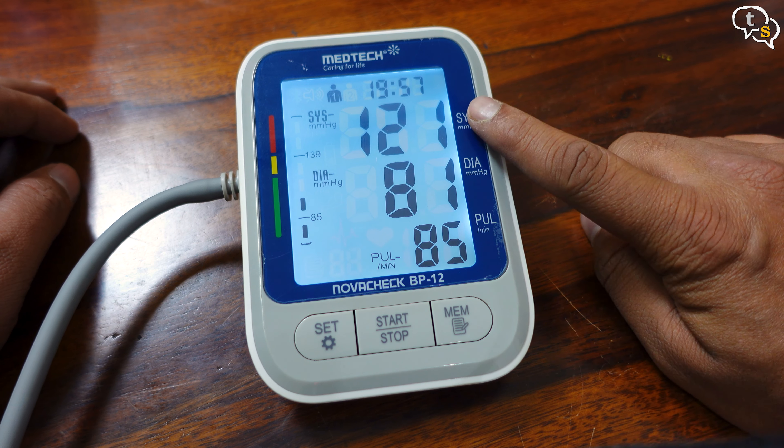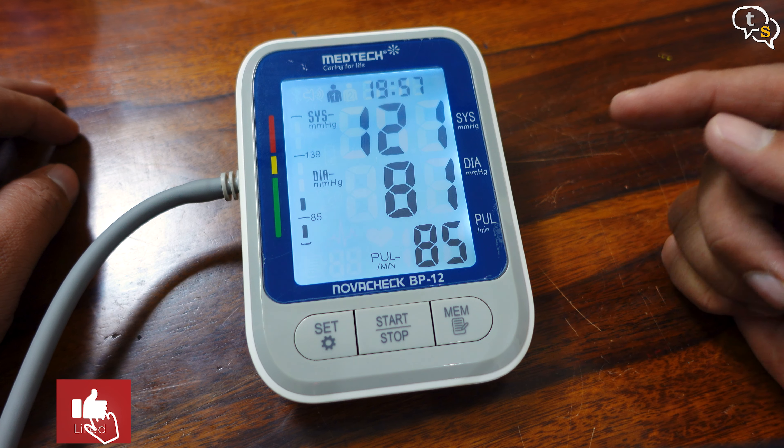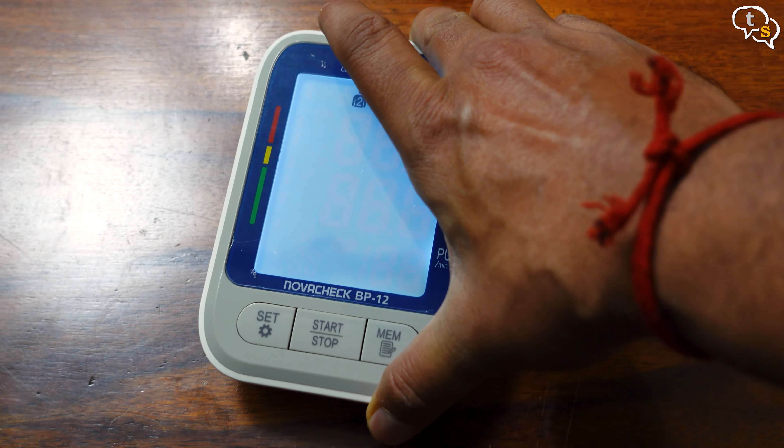That's my reading. I think a healthy BP is around 120 by 80, so 121 by 81 should be fine and the heart rate is 85. The rubber feet below the device keeps it from slipping around when being used.